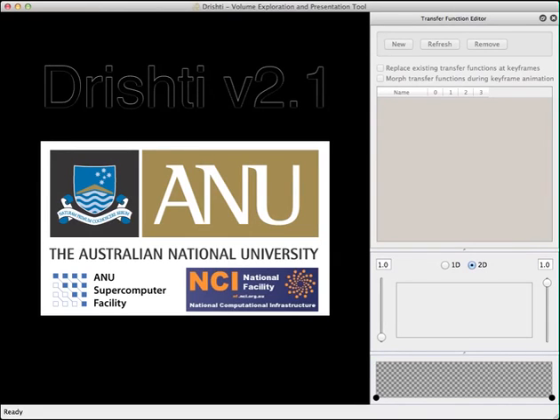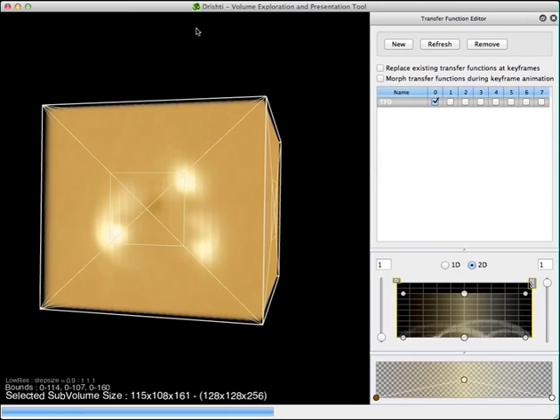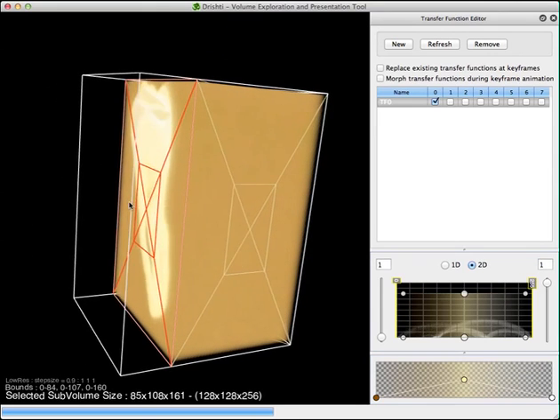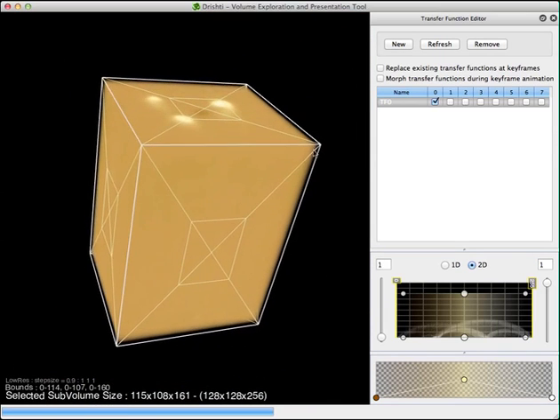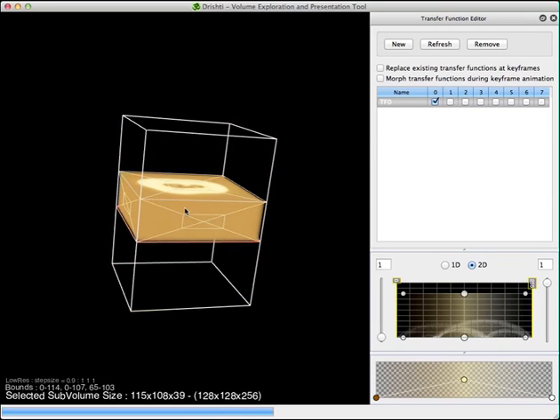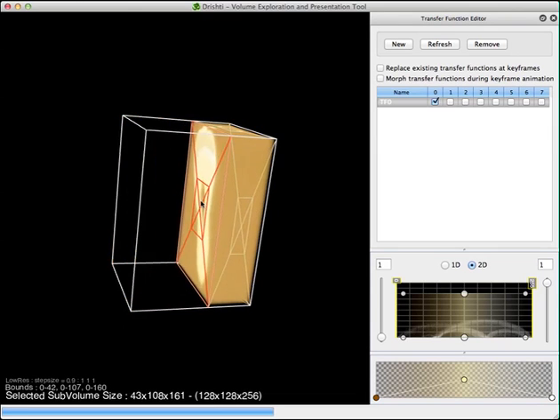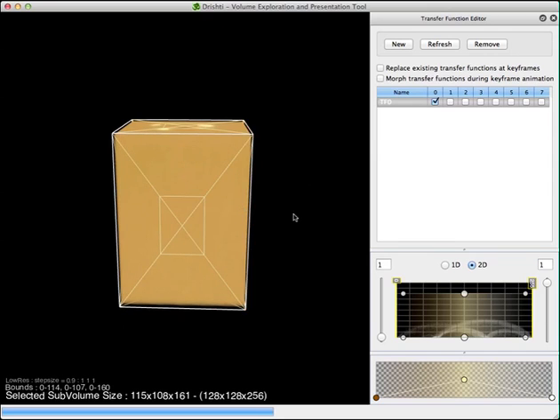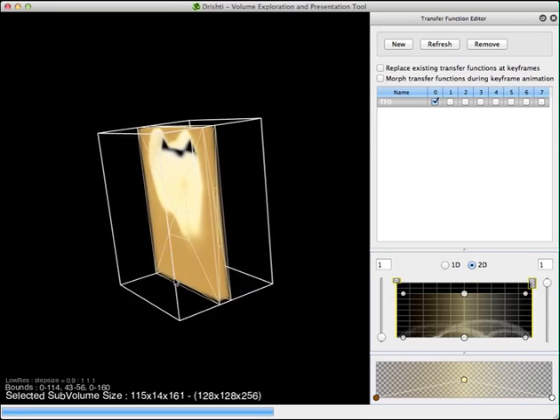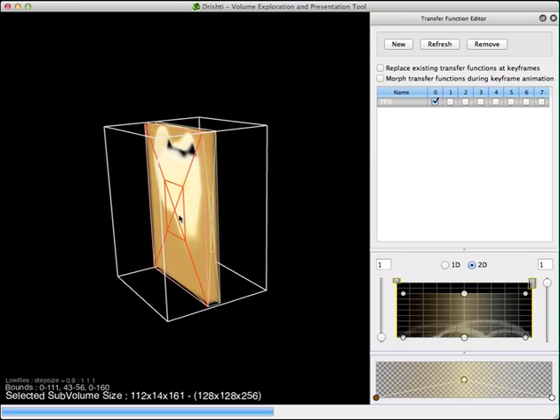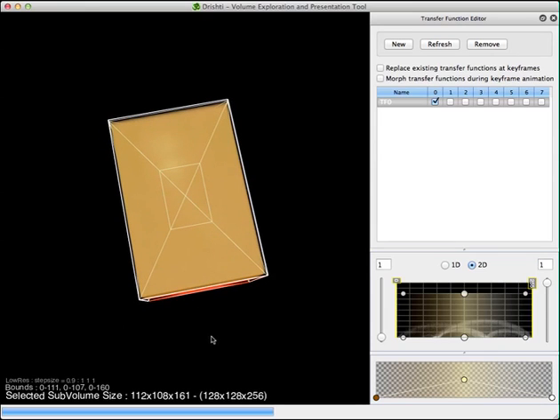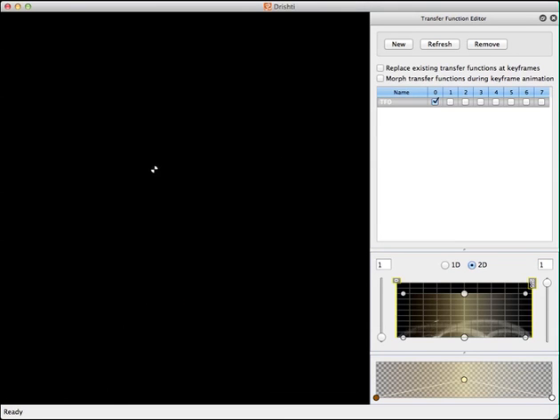This video will show you working with transfer functions. I have loaded the tooth dataset. If you have very big data, you might want to take a smaller section. This grid helps you select a smaller portion of your data, and pressing F2 will take you to the hi-res mode of the selected sub-volume. Let's go into hi-res mode by pressing F2 — this is on Mac.